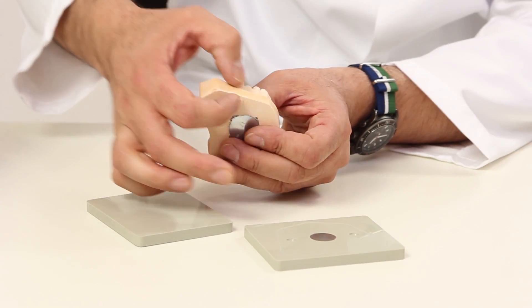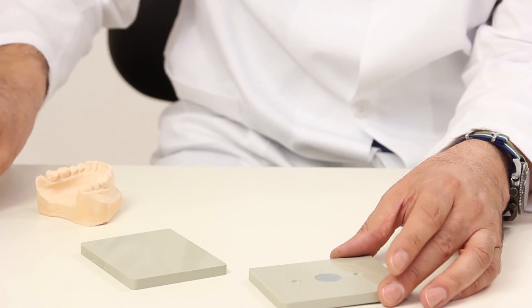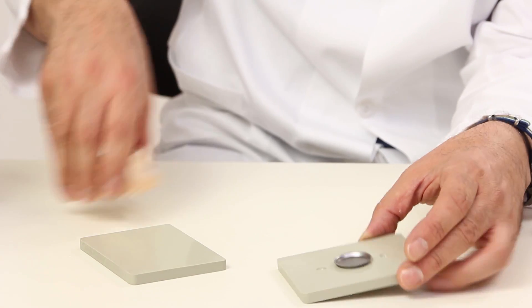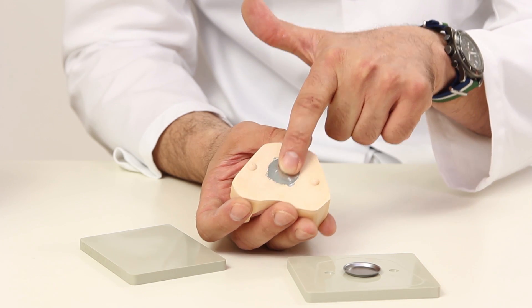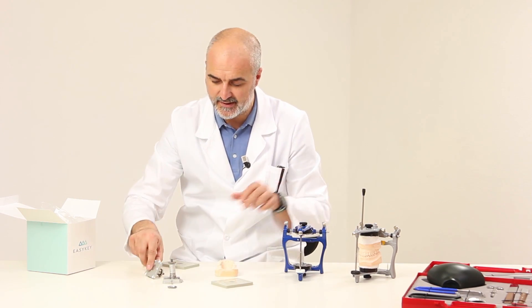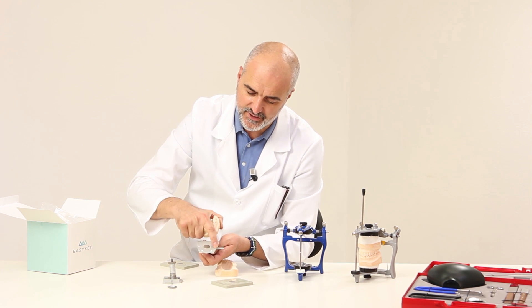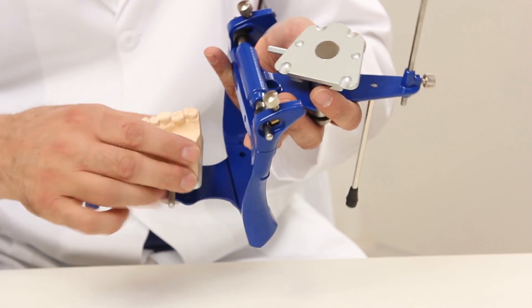When the impression is turned, it is also possible to determine the height of the articulator base — on average, it is about one centimeter. The metal plate is absorbed by the model and these two depressions are repeated in the model itself to provide stability. In this way, the metal plate is united with the magnet present in the system. And here too, these depressions that prevent the model from rotating are present.